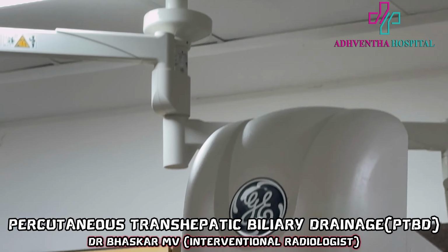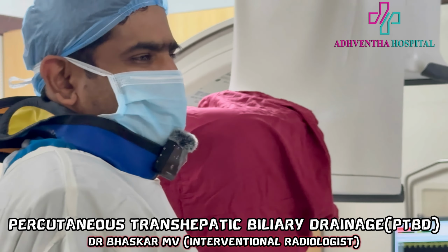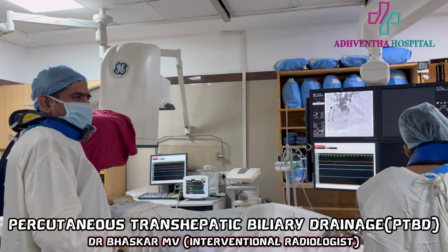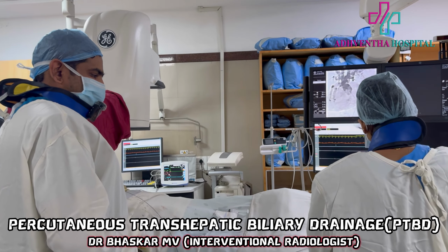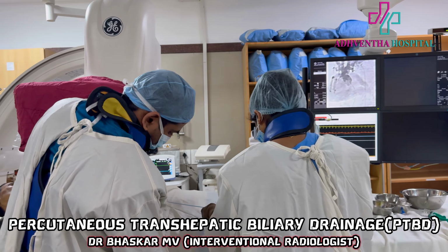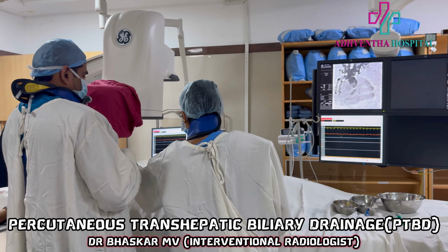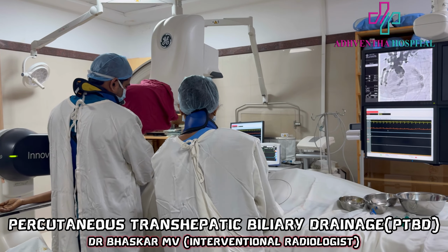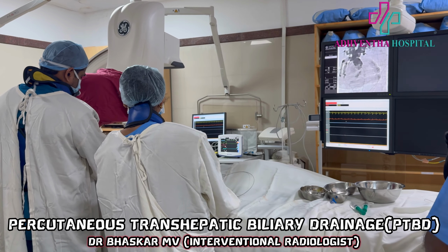Take the next size of the tract. It is the same as when you drain an abscess using a multipurpose drainage catheter. Similarly, you should not lose the access in the meantime. That is the reason. So now the wire tip is located in the jejunum, the fourth part of the duodenum.